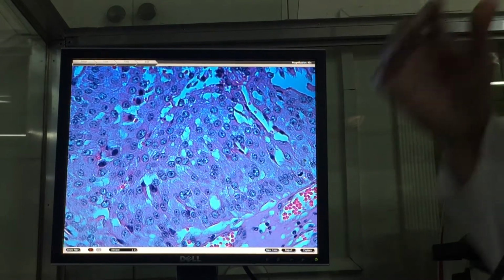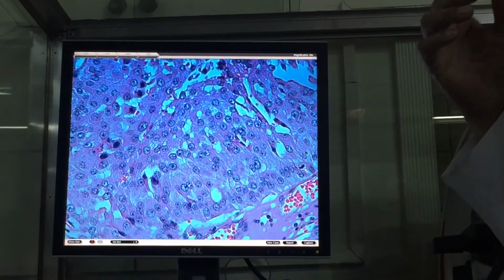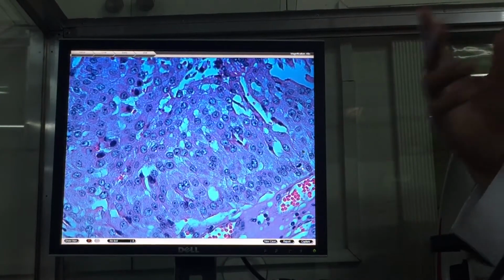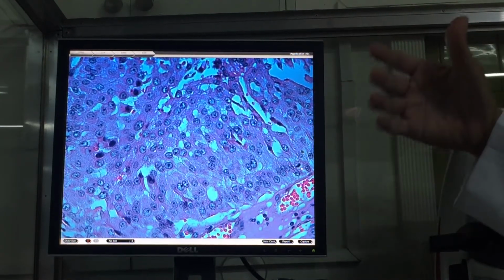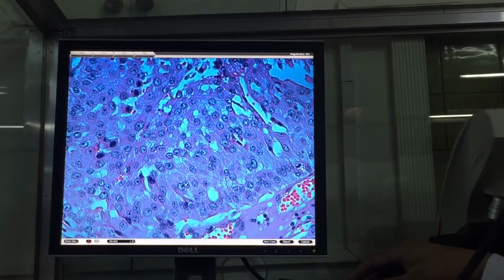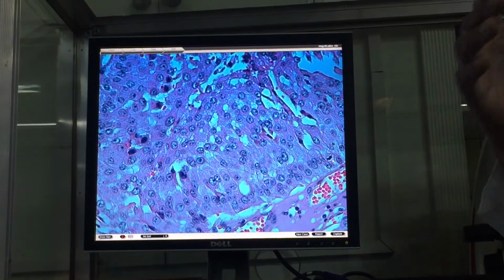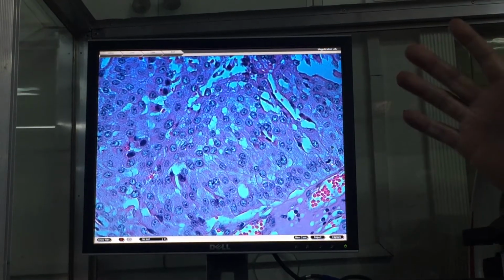Okay, it is divided into types. Actually three. The one is benign papilloma. The other one is low-grade urothelial carcinoma, and the more ominous one is your high-grade urothelial carcinoma. In your lecture with Dr. Gonzaga, I think there was a differentiation of the two.